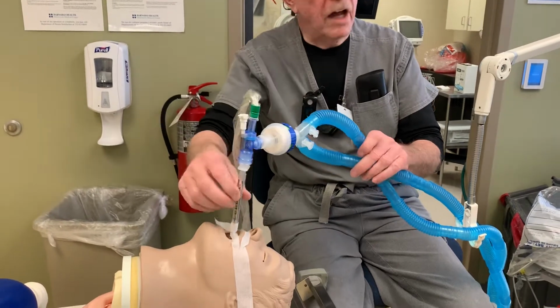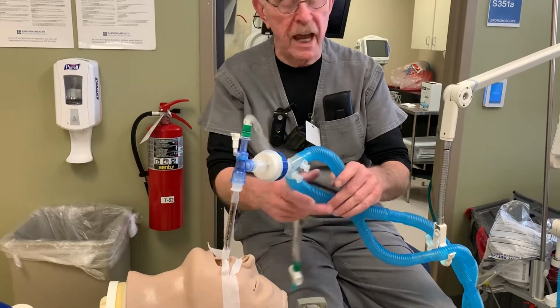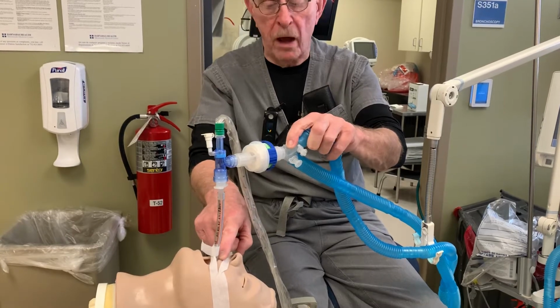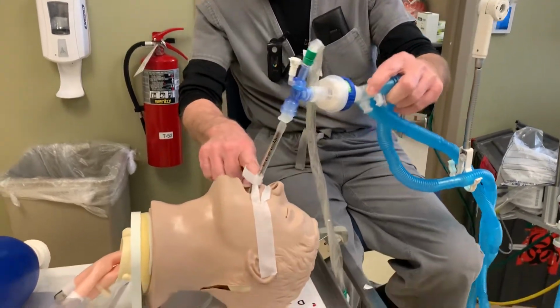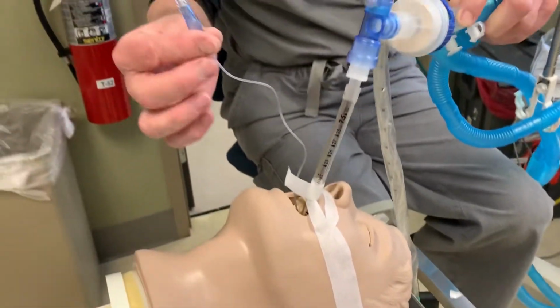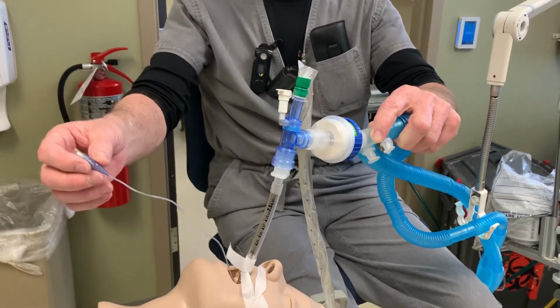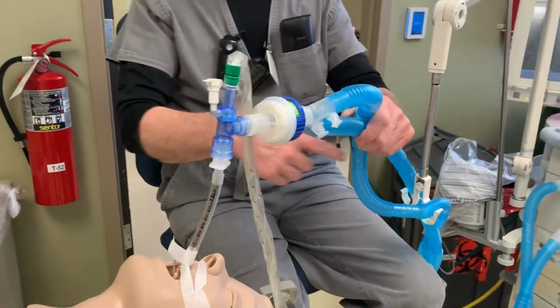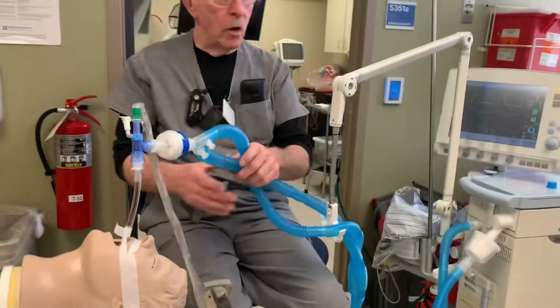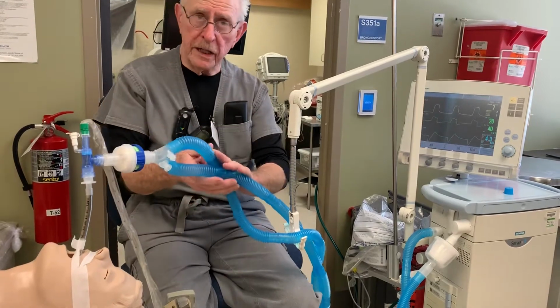This is a cuffed endotracheal tube, placed either by anesthesia or perhaps by the respiratory staff, and we do monitor this. We monitor the position of the tube in the patient's mouth, usually by the top lip. This one's measuring at about 22 at the top lip. We also monitor the cuff at the end of this tube for an appropriate amount of pressure so that you're sealing the system, so everything that's being delivered to the patient returns without escaping around it. Those are the three parts of the system: the patient with the endotracheal tube, the circuit itself, and the ventilator itself.